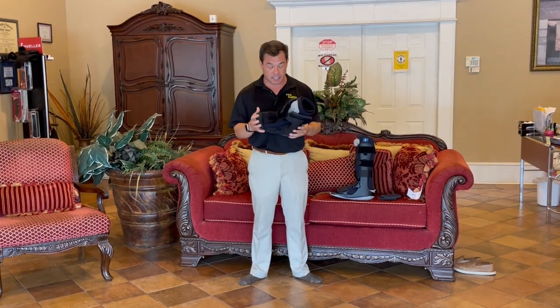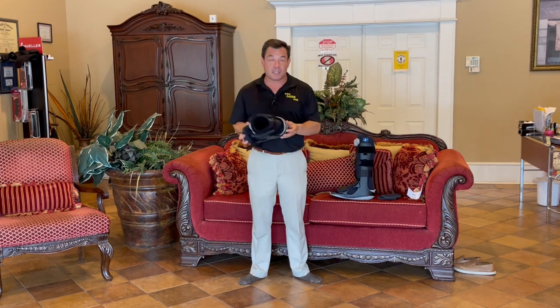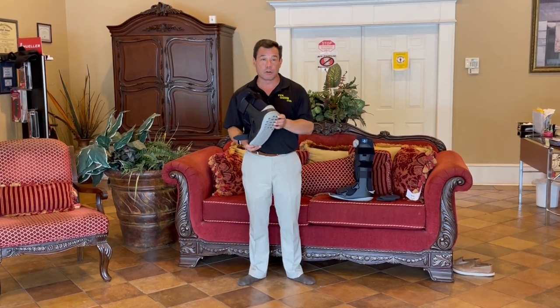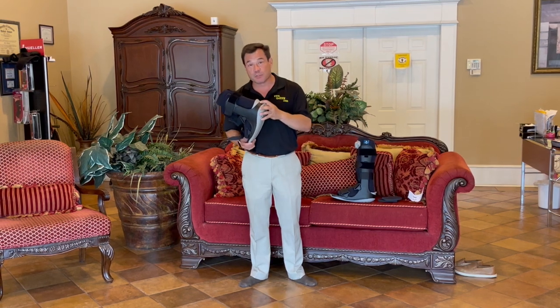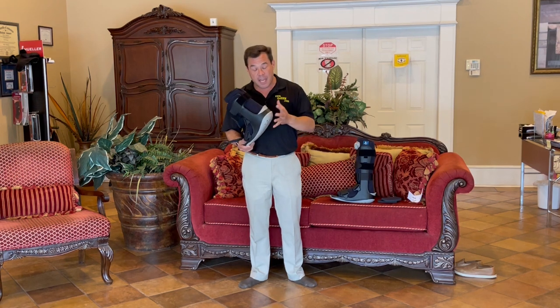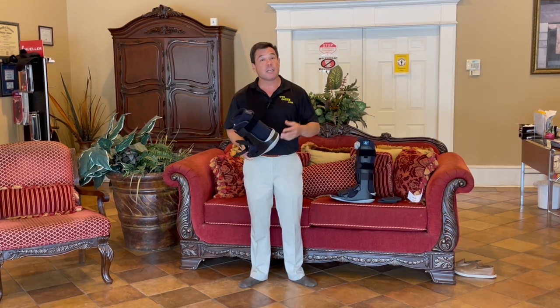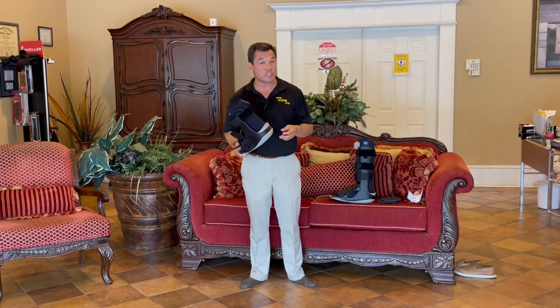The second thing that this has, which is also incredibly nice, is it has a shock absorbing heel. This heel absorbs more shock than any other walking boot on the market. Because as it absorbs that shock as the patient is walking along, that means there's less shock transferring into the foot where the damaged area is, and therefore there's less pain and also less risk of re-injuring that particular area.